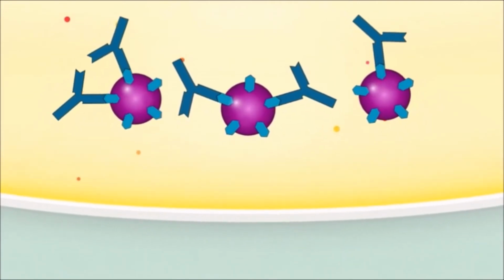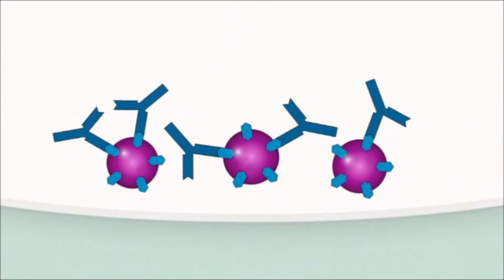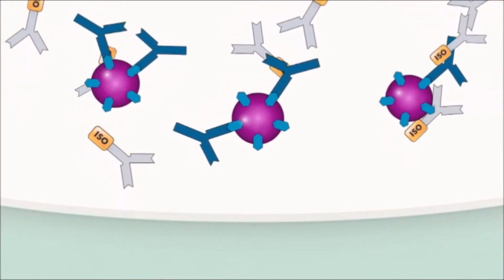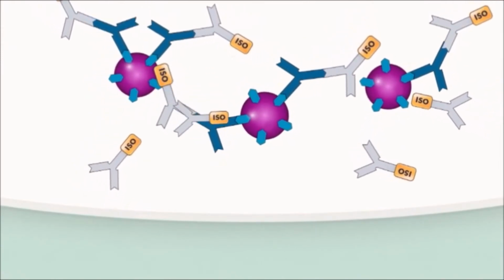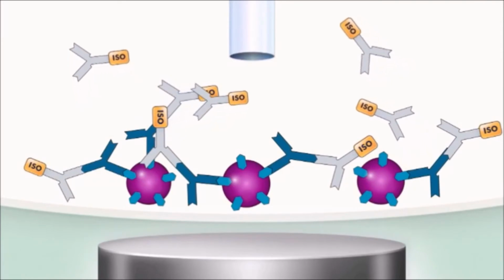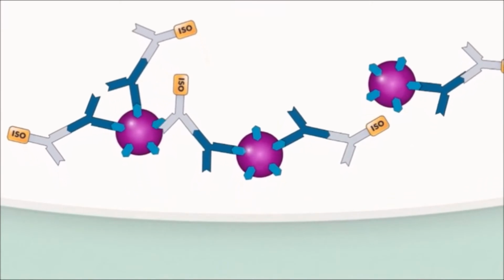To accomplish this, the magnet attracts the antigen-antibody complexes in the cuvette. The plasma and residuals are then automatically removed. The magnet retracts, releasing the antigen-antibody complexes. A secondary antibody, labeled with isoluminol, is added as the tracer element, which binds specifically to the initial antigen-antibody complexes. The magnet once again attracts the complexes. The unattached isoluminol-labeled tracer is automatically removed, and the magnet retracts, releasing the complexes.